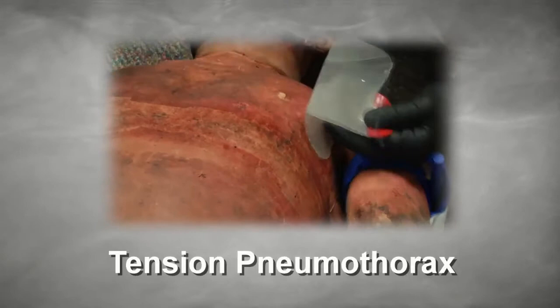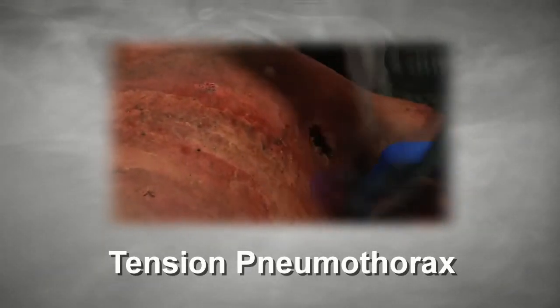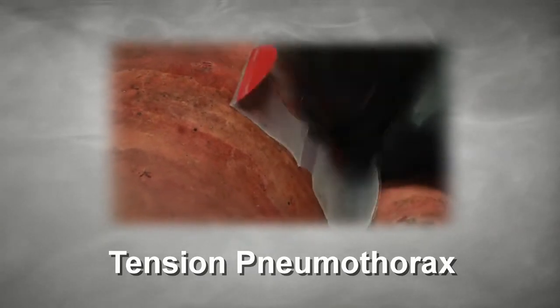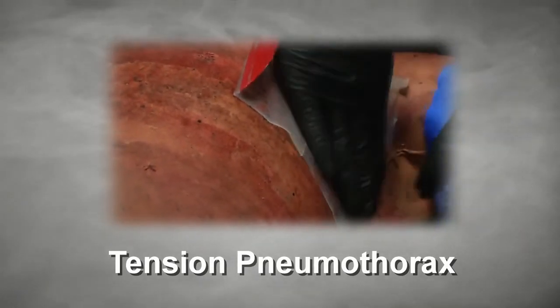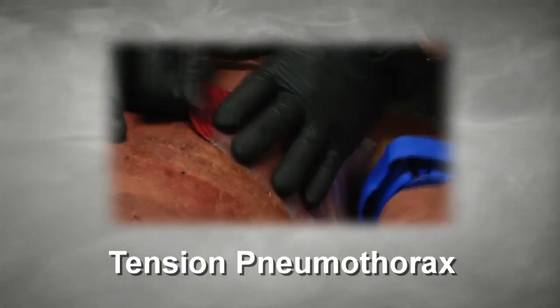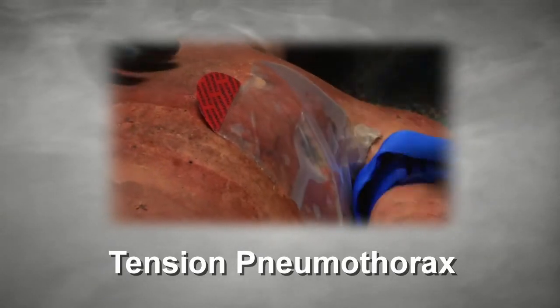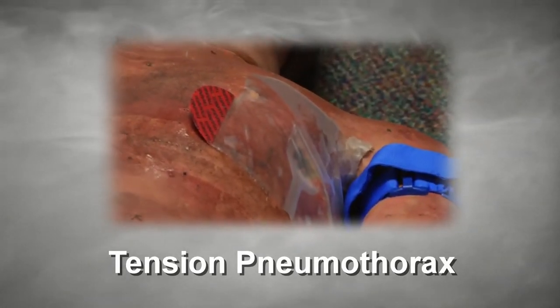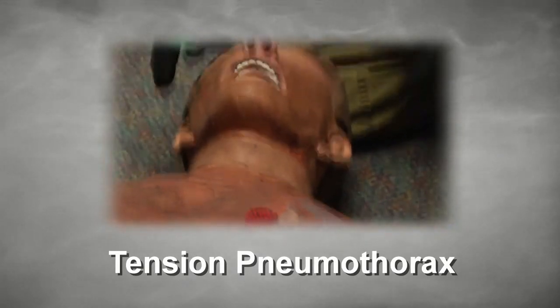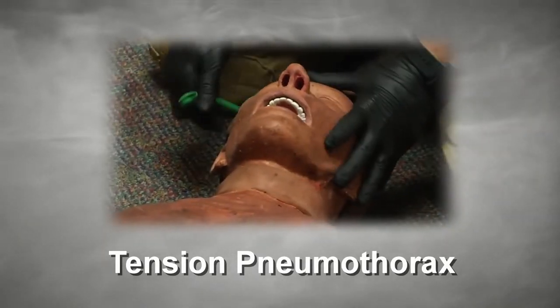Any injury that they have that's penetrating into any of those areas, we're going to cover with a vented chest seal. However, if air then leaks from the injured lung tissue and cannot escape, a tension pneumothorax can form. The vented chest seal is designed to allow air to escape, but it can become blocked with blood or other debris. For this reason, if the patient develops shortness of breath, altered mental status, or other signs of decompensation, a corner of the chest seal should be quickly lifted, then replaced to allow air to escape.